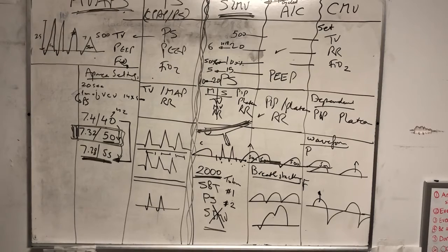Or you can squeeze the vent tubing if you want. Just one of our respiratory therapists here likes to fold the vent. So keep squeezing the vent tubing, and the vent thinks that the patient is breathing. Or you can change the apnea settings to 60 seconds. That's the least preferred, because that will remain as the default for the next patient. So whatever you do, just let the patient breathe. I can make anybody breathe as long as they're awake. Okay, so that's your apnea settings here.